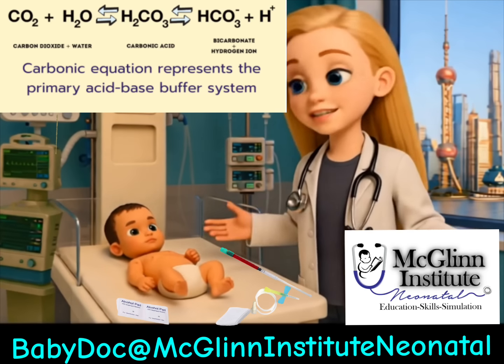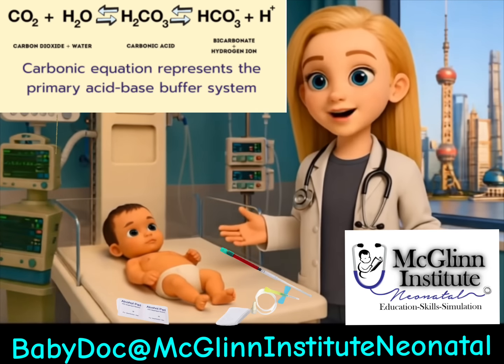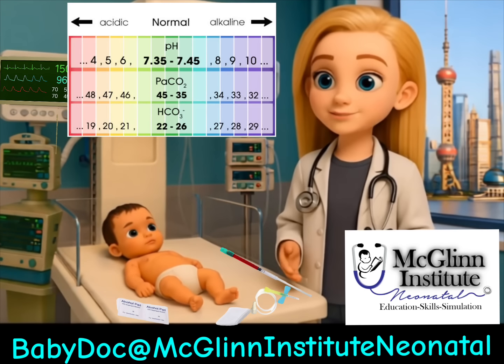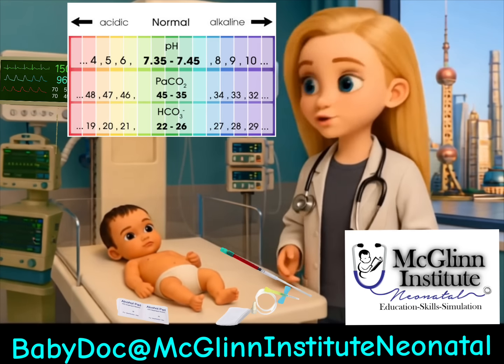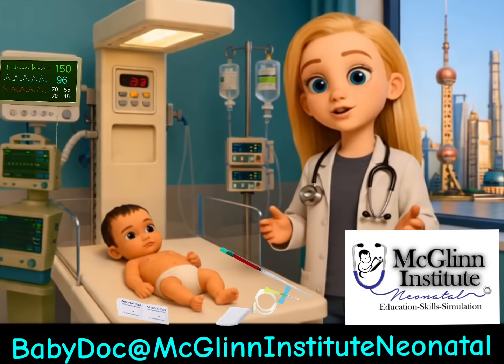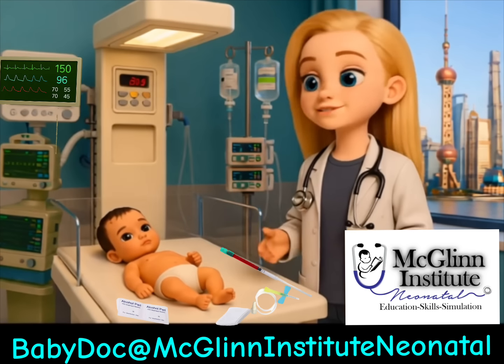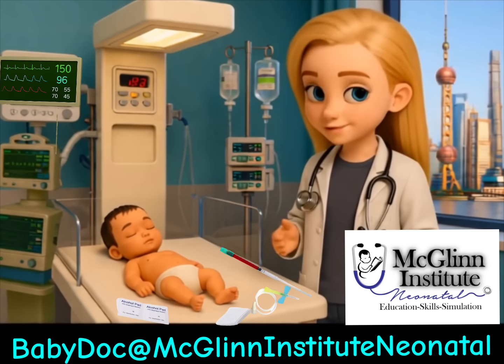The third step is to look at the HCO3, bicarbonate. This is the metabolic component and is regulated by the kidneys. Remember basic chemistry. Normal bicarbonate levels are 22 to 26 milliequivalents per liter. A bicarbonate of less than 22 causes a drop in pH known as metabolic acidosis. Some causes of metabolic acidosis include renal failure, sepsis, and perinatal asphyxia.